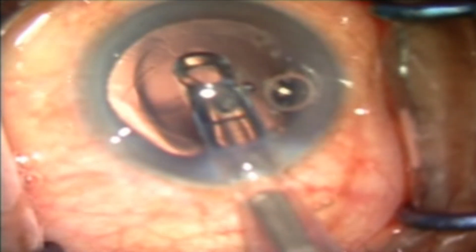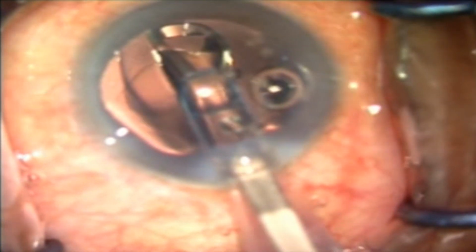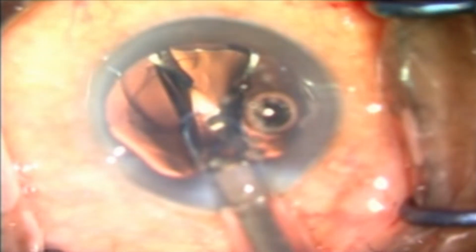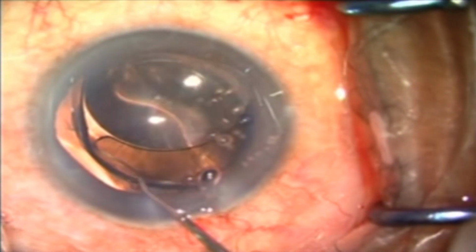Once you have managed the PC tear and the vitreous loss very competently and effectively, then if the PC tear is small, we can go ahead with a single piece lens in the bag.